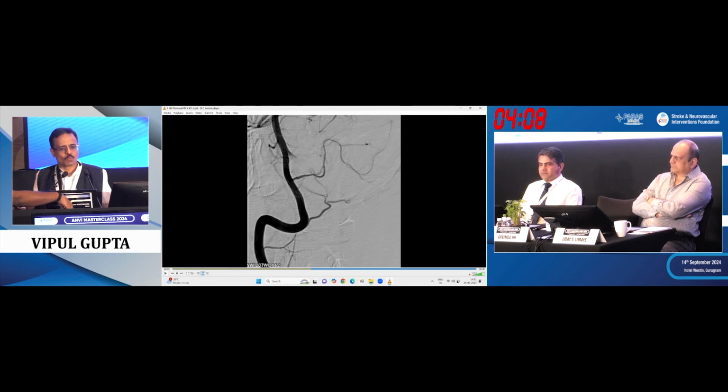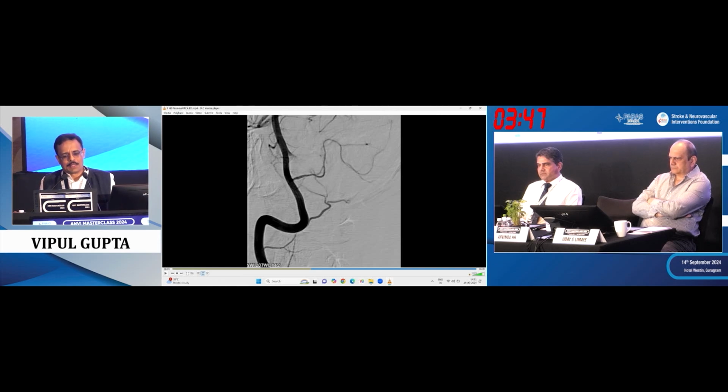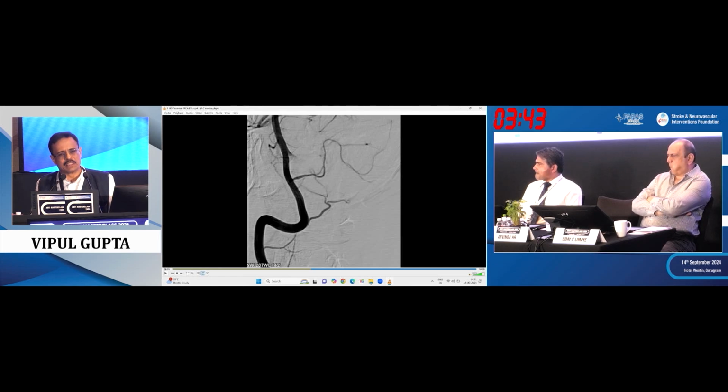So my understanding is probably there was collaterality, do you think? Yeah. I mean, I would have been really afraid to occlude this artery as well, but I see that probably it could have been done, but I would have been conservative as well, but probably yes. You see, it was a PICA, as I understand. Yeah. The ICA was very small. It was a huge artery. The vertebral and PICA artery, so very huge artery. And the problem was, it was all diseased till the proximal.